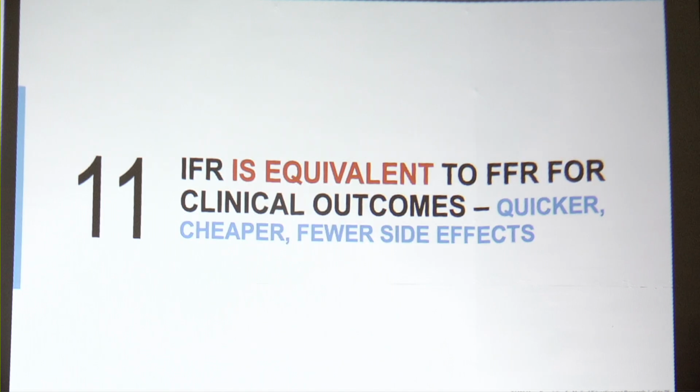So point number 11, moving on to non-hyperemic indices, it's fair to say that iFR is equivalent, and in fact, most of us are now using iFR routinely. That's really our go-to because it's quicker, cheaper, with fewer side effects because you don't have adenosine.